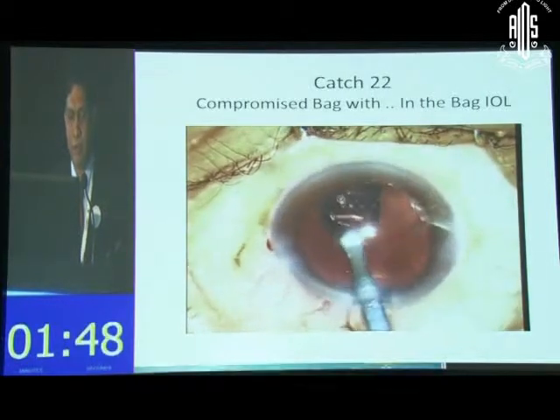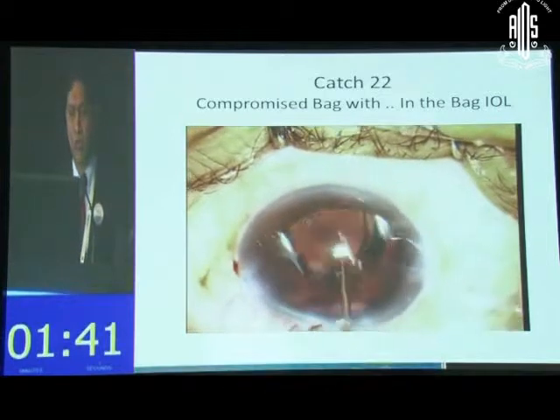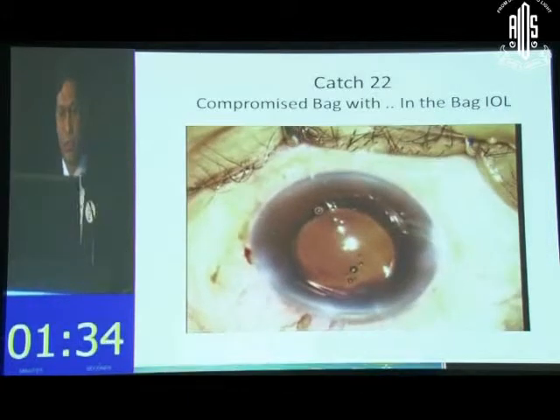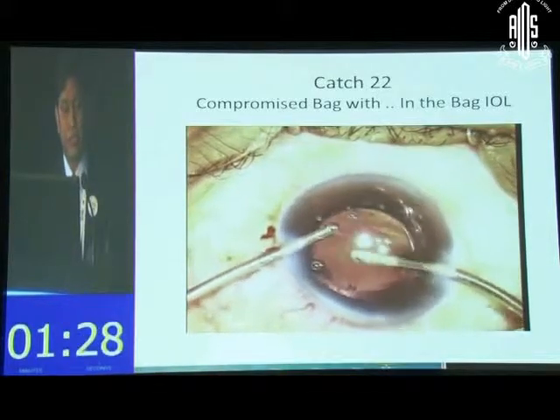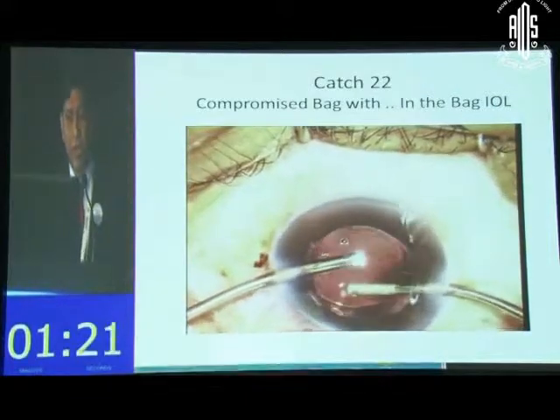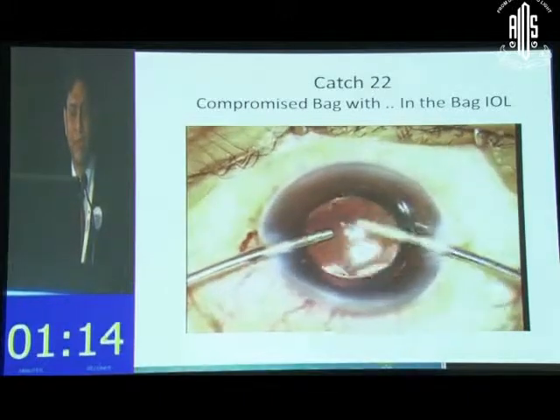I didn't know what came upon me. I just kept pushing and pushing that injector all the way. By no stretch of imagination could that bag be so huge. I think I was trying to put the trailing haptic back into the bag in one go. For me to think that the bag was still intact is all the more stupid. I'm doing IA, trying to see if the lens moves or wobbles, and then I'll pull it. I need an excuse to pull it out. Nothing is happening. That lens is absolutely rock steady.